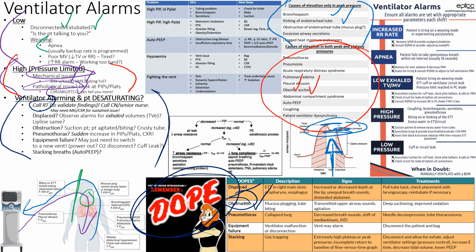End-tidal, right? End-tidal is going to give what kind of appearance? A little shark fin appearance. That'll tell you that you have a bronchospasm at work. And we can then, RT's there, or you can call them on the phone and they're on their way and say, hey, go stop by the Pyxis and get me some albuterol, right? I need some breathing treatments.